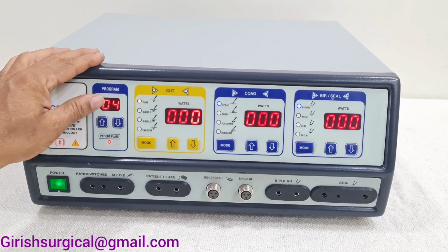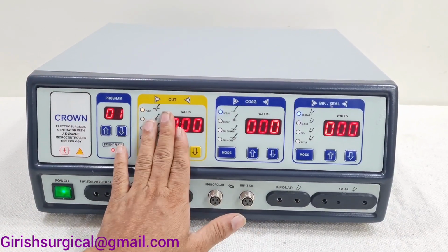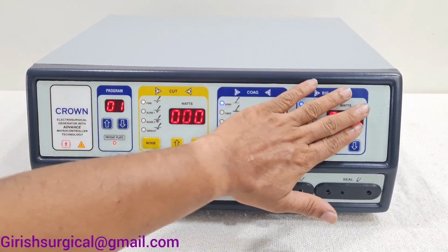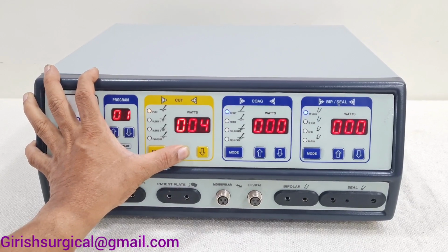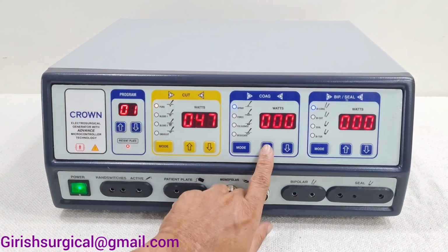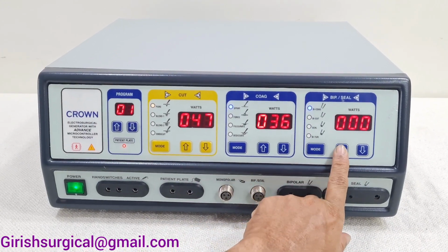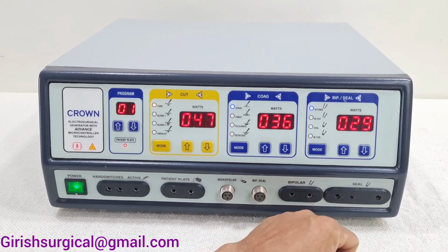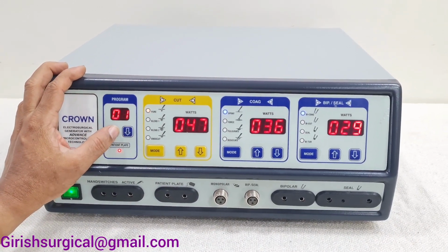Now suppose a neurosurgeon comes and does the surgery and keeps his settings in memory. Now cut is 0, coagulation is 0, bipolar seal, everything is 0. It is completely plain, no output. So he sets the program and increases the output of cut to around 47, the coagulation to 36, and bicog to 29.